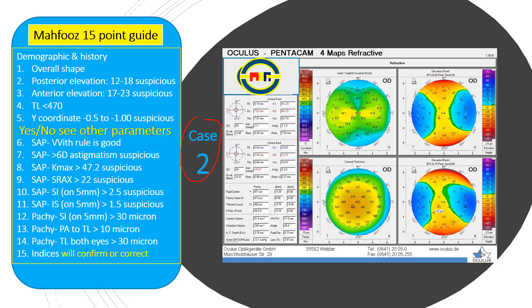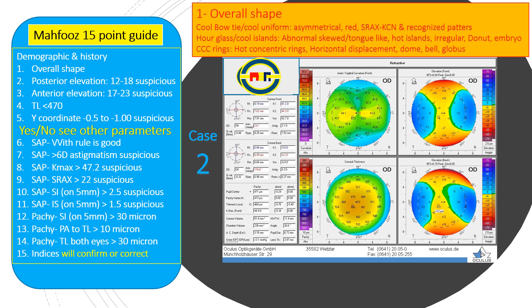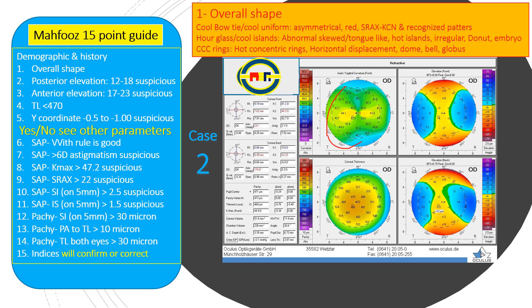In case number two, the overall shape on the sagittal map shows a bow tie which is not as regular as in case one. The posterior and anterior elevation maps have cool islands, but on the pachymetry map the rings are central concentric but not cool — we have hot rings. So we have a slightly irregular bow tie and hot rings, pointing towards abnormality in the cornea.